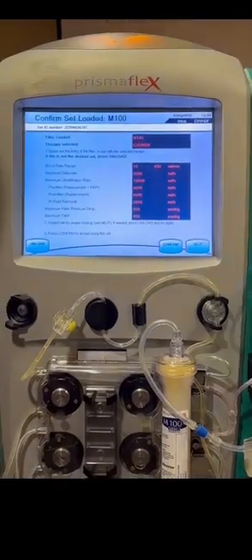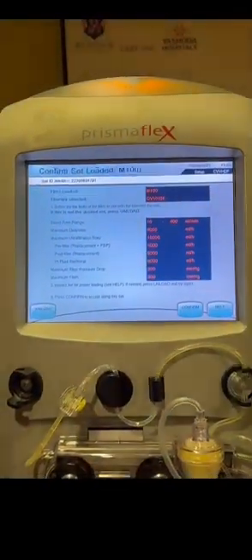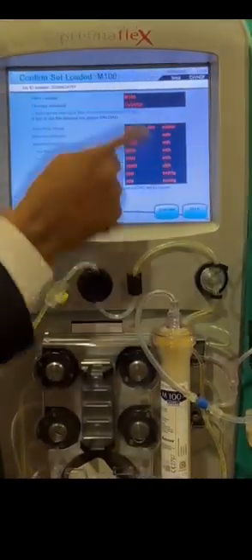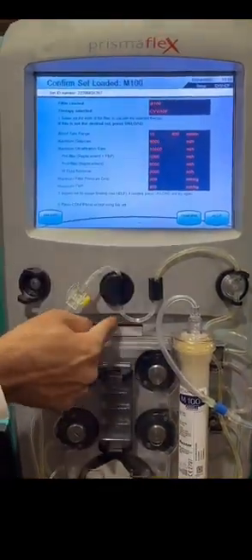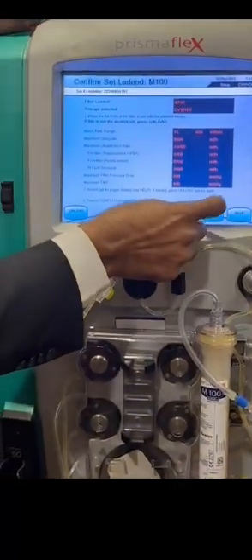So now the machine has identified which filter we have connected. It is M100. If I connect M60, it will identify that. Here there is a barcode reader, so it read that it is M100. So we can confirm that.